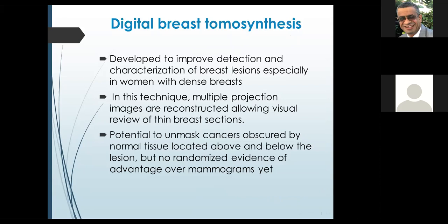Digital breast tomosynthesis, a development to improve detection and characterization of breast lesions, especially in women with dense breasts. In this technique, multiple projection images are reconstructed, allowing visual review of thin breast sections, with potential to unmask cancer obscured by normal tissue located above and below the lesion, but no randomized evidence of advantage over mammogram yet.